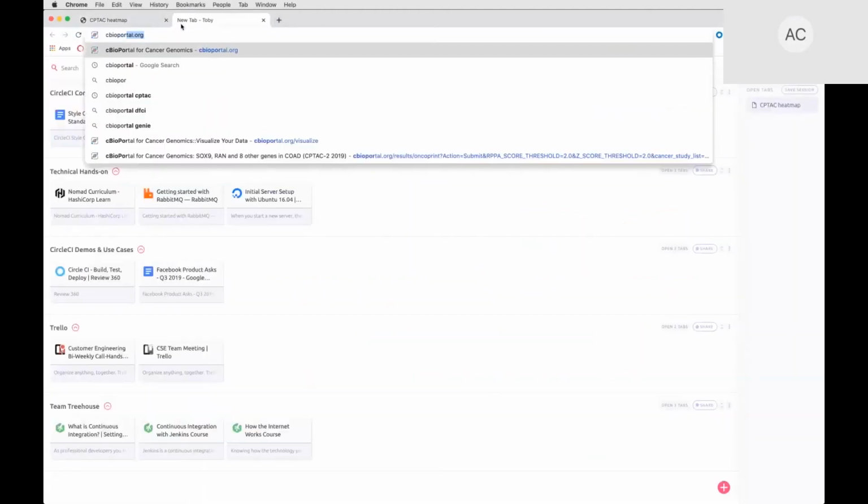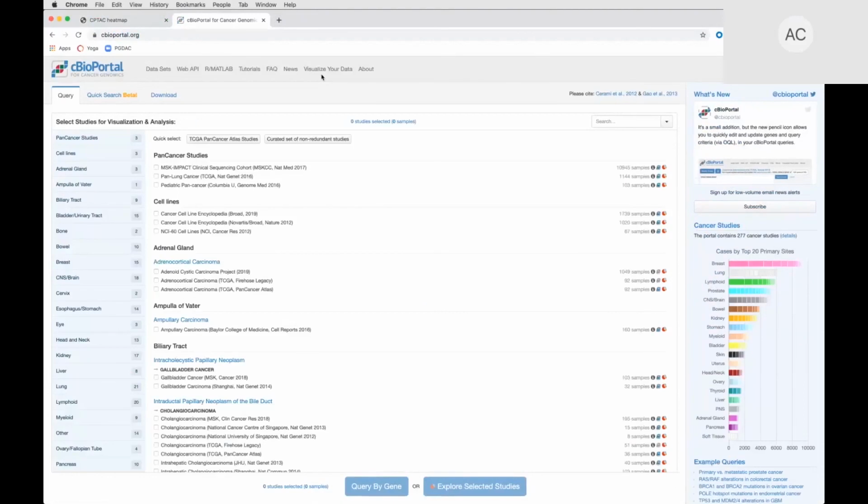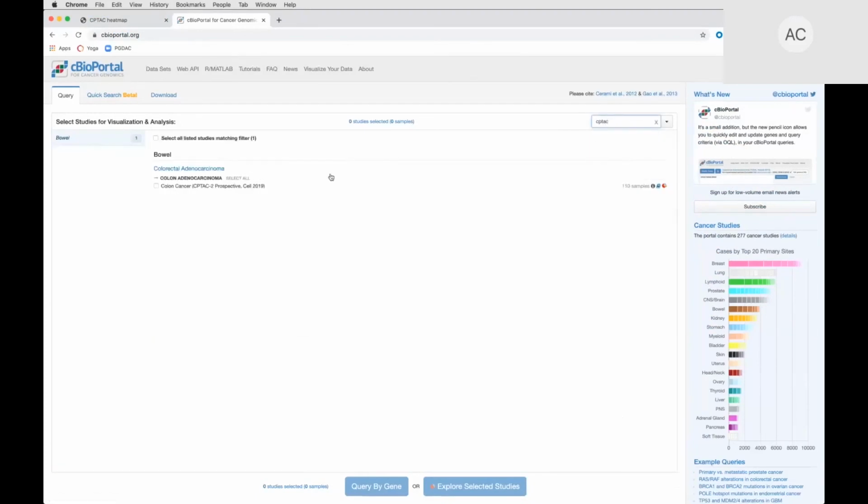One of the best tools out there for heatmap visualizations and specifically looking at cancer molecular data is cBioPortal. And so I wanted to show the difference in using cBioPortal, which is a great tool that I highly recommend, and why Protrack is a more accessible version of this. I'm here on cBioPortal, and I want to search a CPTAC study. First of all, it's still quite limited what CPTAC data is available on this platform, whereas we are producing one of these portals for multiple cancer types as we go along in CPTAC.